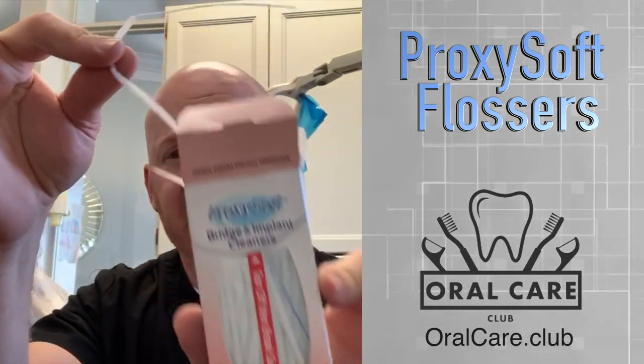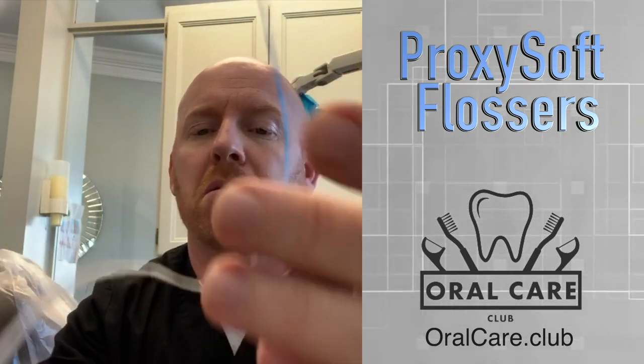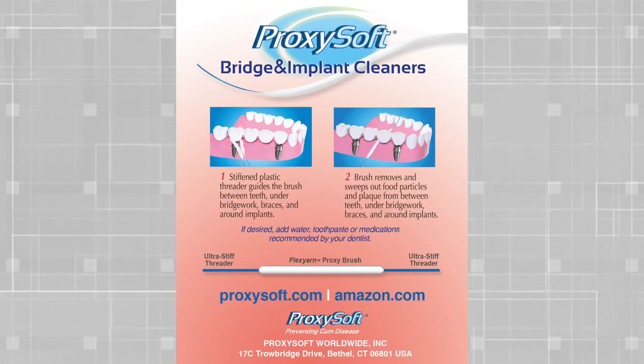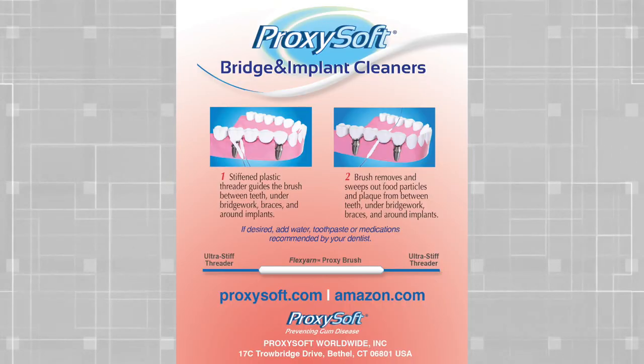But Proxisoft — I'm going to take out one of these flossers here. What Proxisoft has done is they've made a piece of floss that is puffy. If you can see that there, the floss is really, really thick. It's not hard thick — you can pull it tight and it gets kind of spongy, but it gets pretty thick. Now at the end, it's got a harder end.